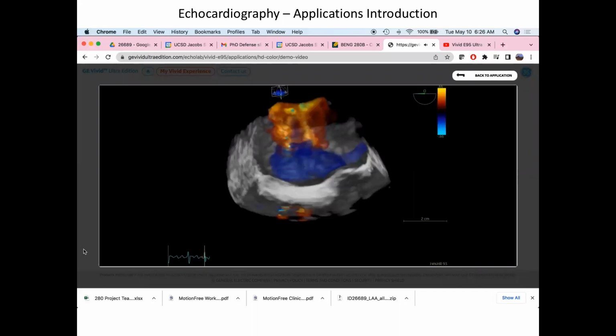So the question was, does this work, or it probably doesn't work, or maybe it's a statement, in atrial fibrillation patients? And the thing about atrial fibrillation patients is that their atrium has lost the ability to be the pacemaker of the heart. It kind of randomly fires. And so their R to R interval between QRS depolarizations is a random number. It has a mean of, you know, 65, but it's 65 plus or minus, you know, 20 sometimes, because sometimes the heart will sit there for a long time and not beat.